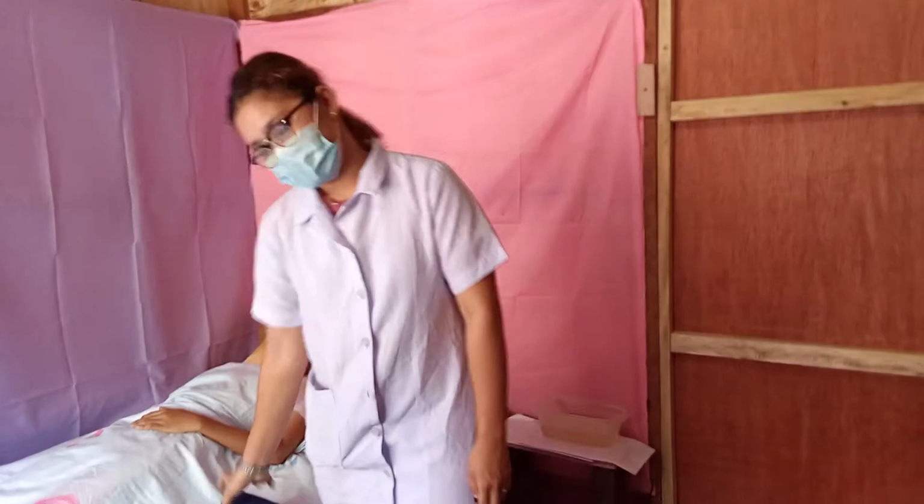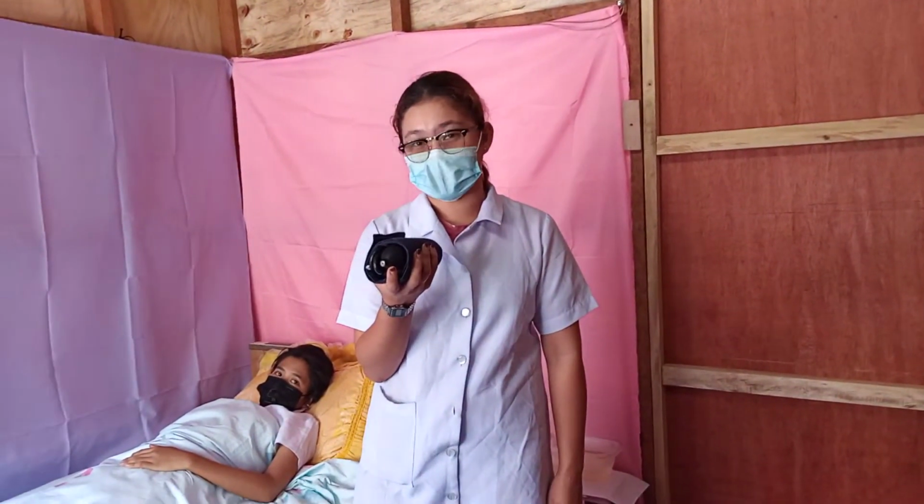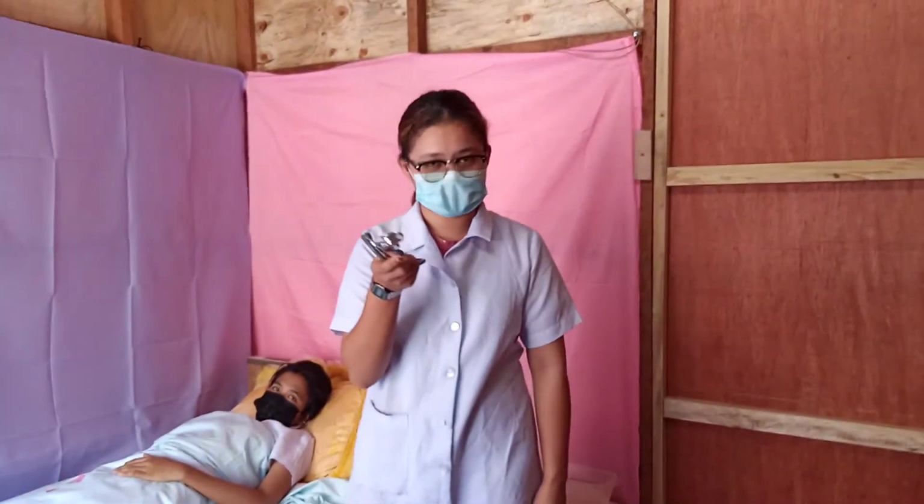vascular resistance. So the equipment for the blood pressure taking, we have the sphygmomanometer, the stethoscope, the pen and the paper, and lastly, the cotton with the alcohol.